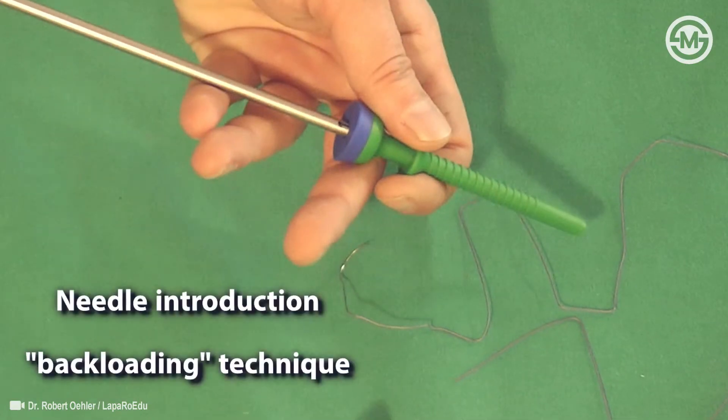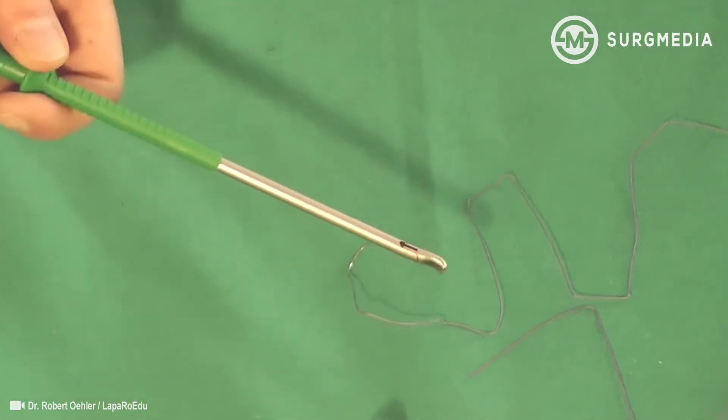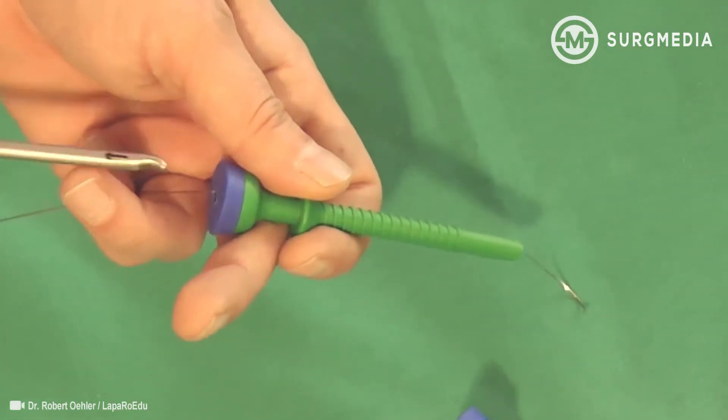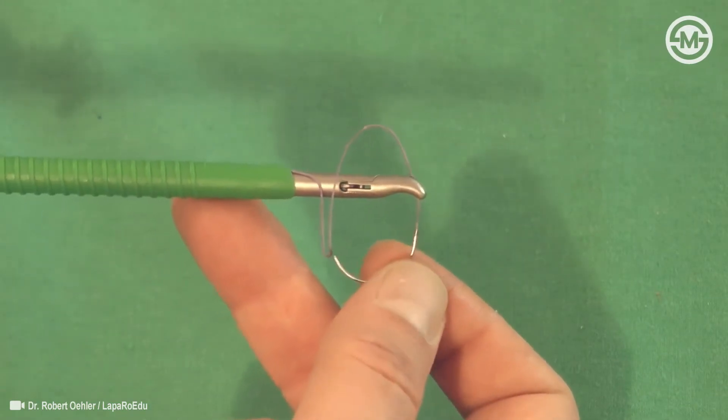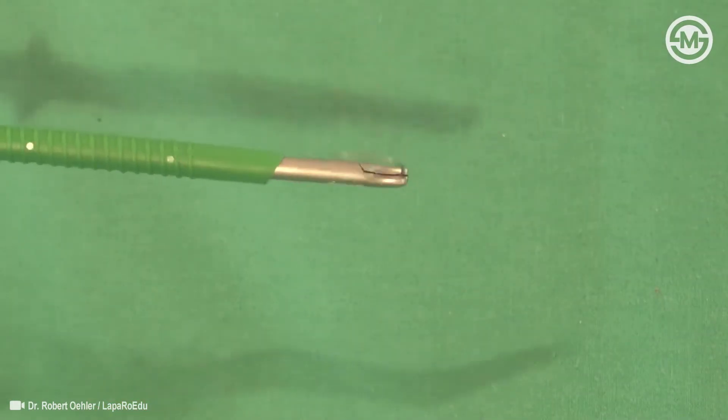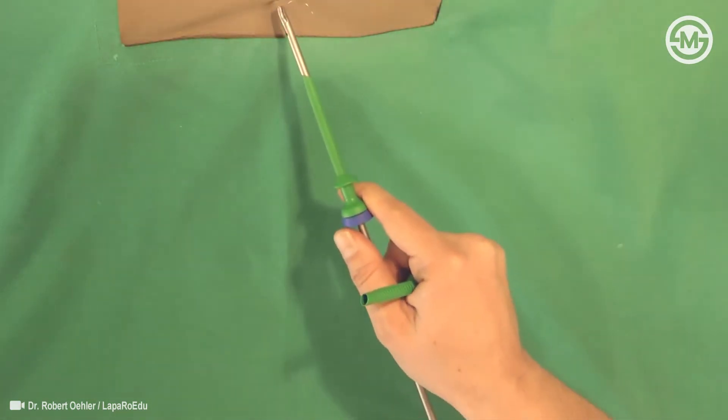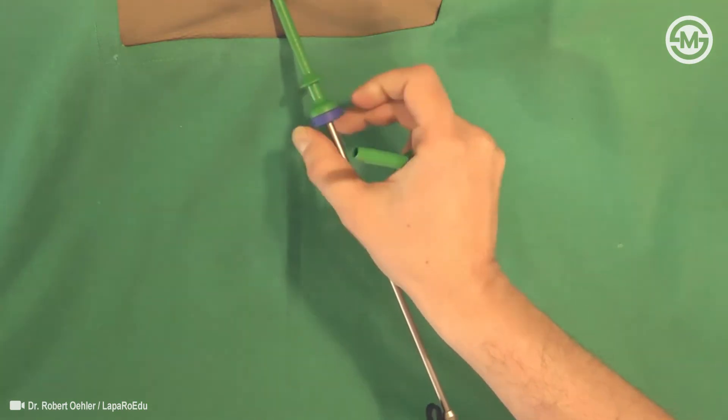Needle introduction with a 5mm trocar is accomplished using the following steps: insertion of the left-hand needle holder, pulling the thread through the extra trocar, and re-insertion of the needle holder. The left needle holder will grasp the thread about 1 or 2 cm close to the needle. The left abdominal trocar is removed. The needle holder with the needle is introduced into the left abdomen, and the trocar is pushed over the needle holder.